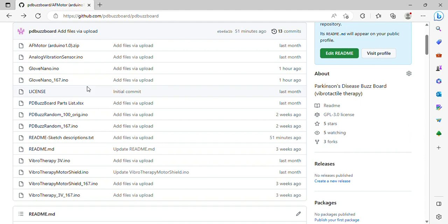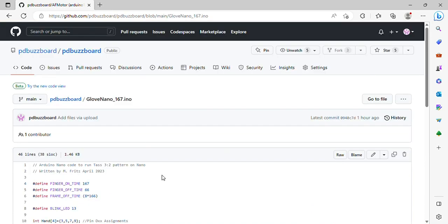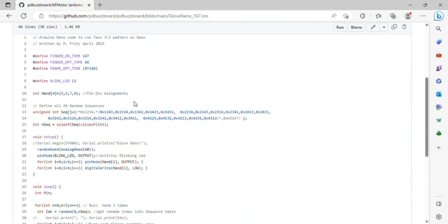A number of folks have asked if they can modify or make changes to the code. Of course — PD is very personal, and different code gets different results. Not everything works for everybody. Starting with Michael's code for the random, at the top you'll see finger on time — this is the pulse time of the motors, the time the motor will be on. Finger off time is the pause between pulses, and then the frame off time, here at 8 by 166, is that pause. So if you want a shorter or longer pulse, you can change this; if you want to shorten or lengthen the pause time, this is where it's done.